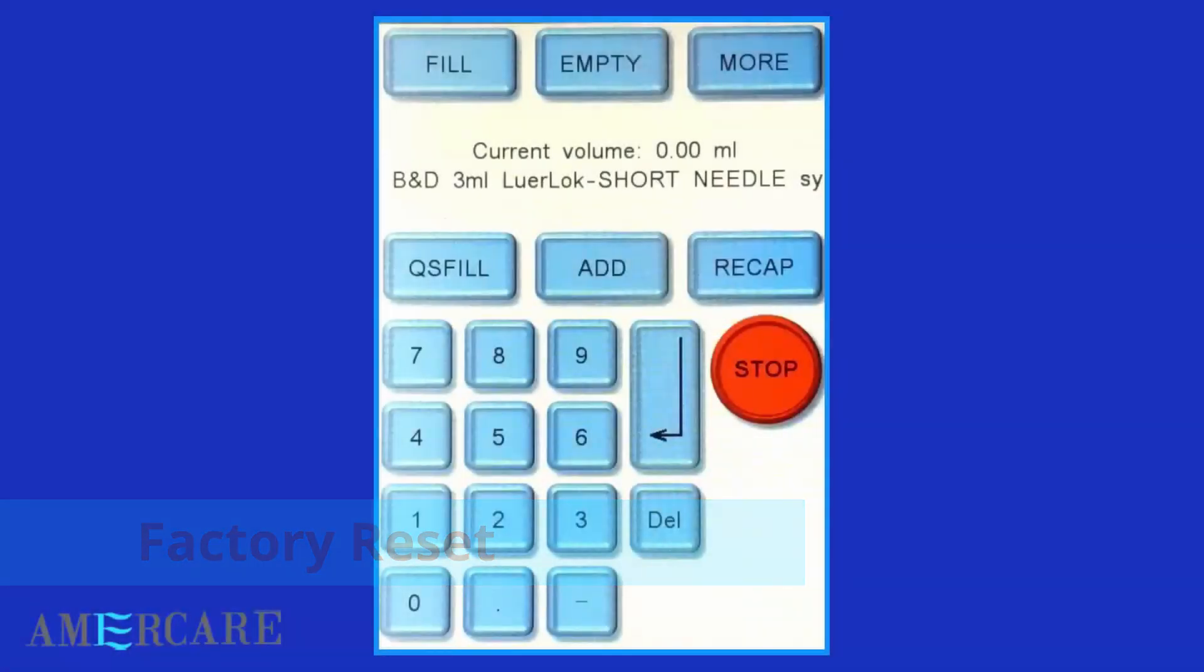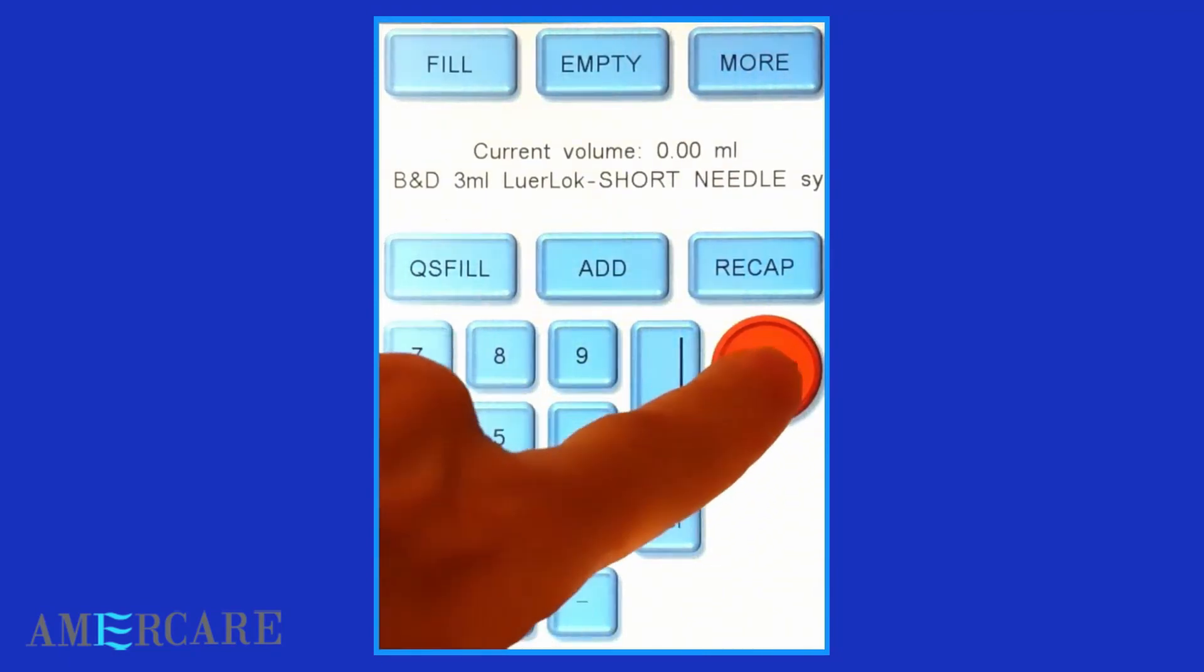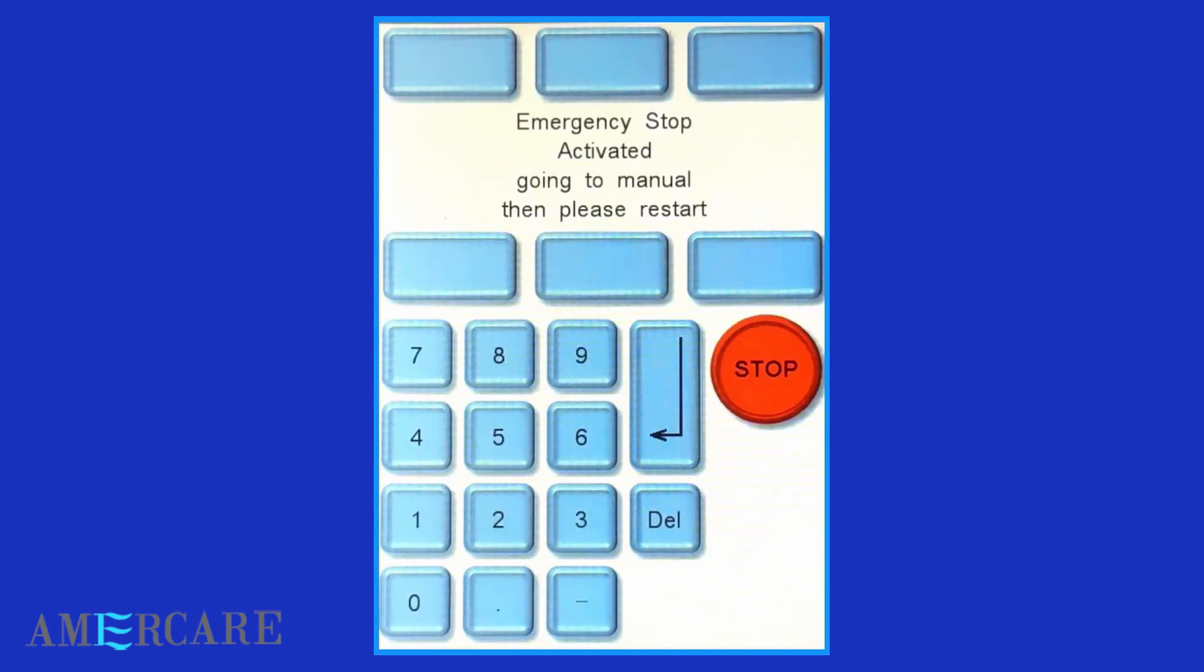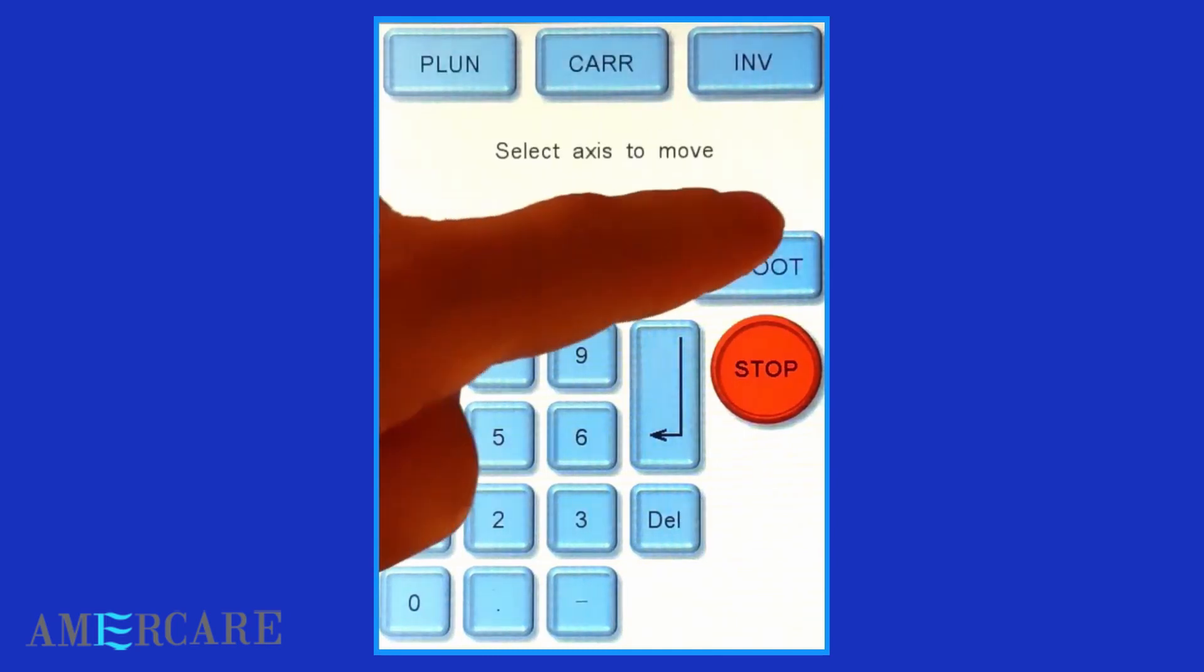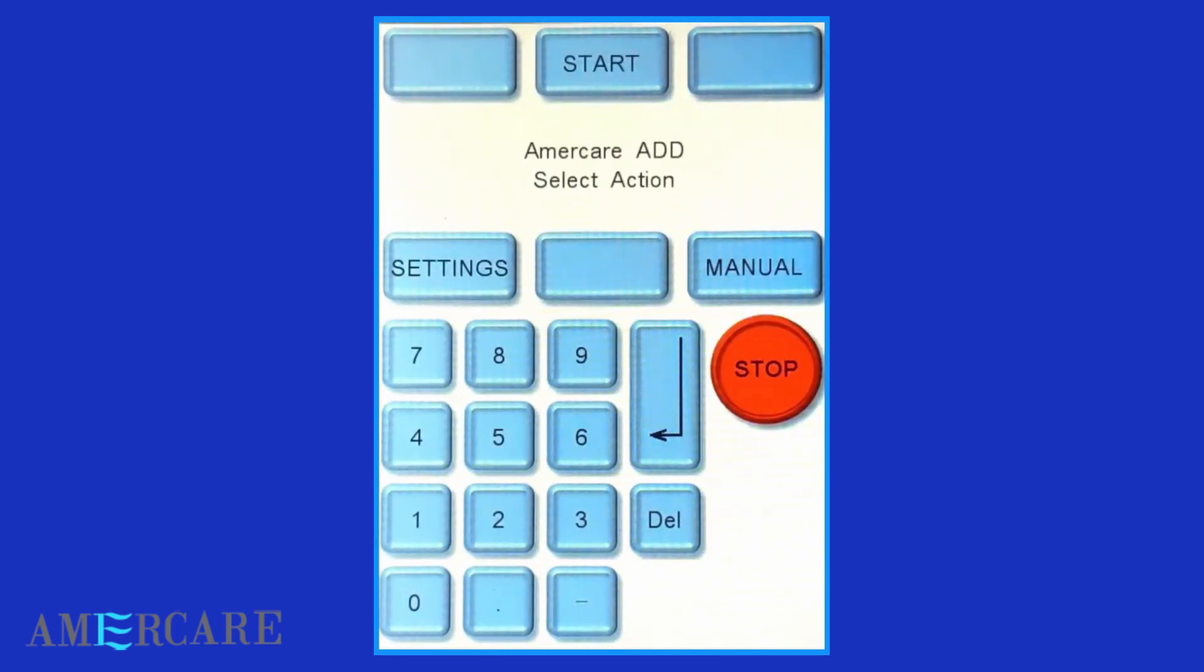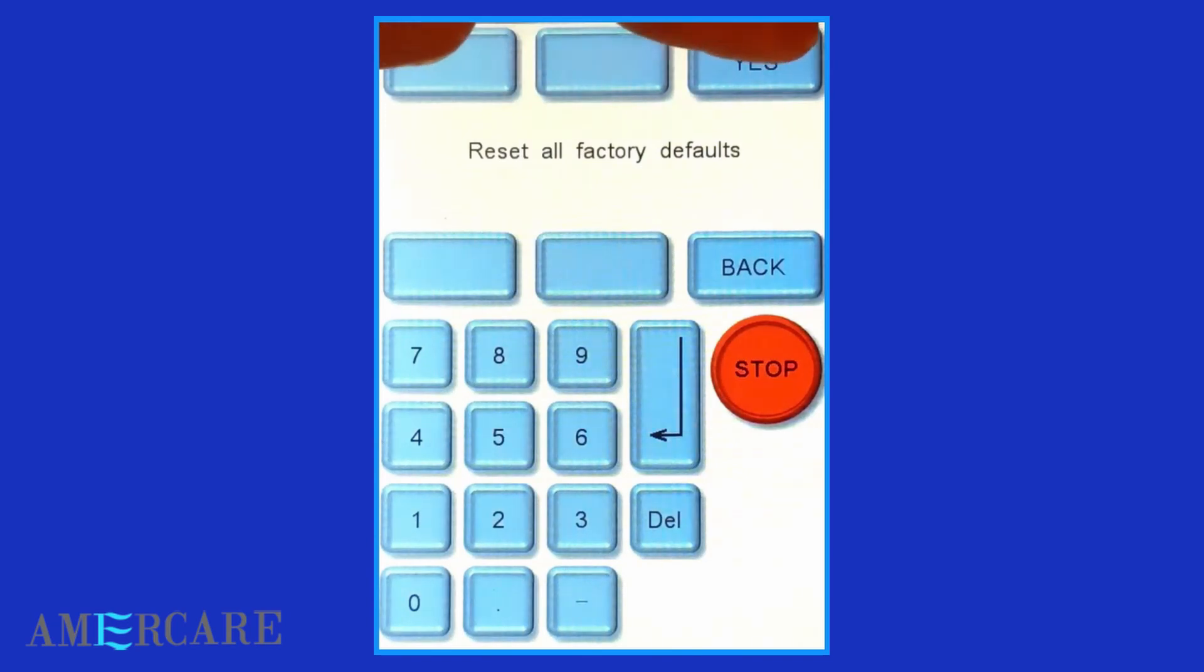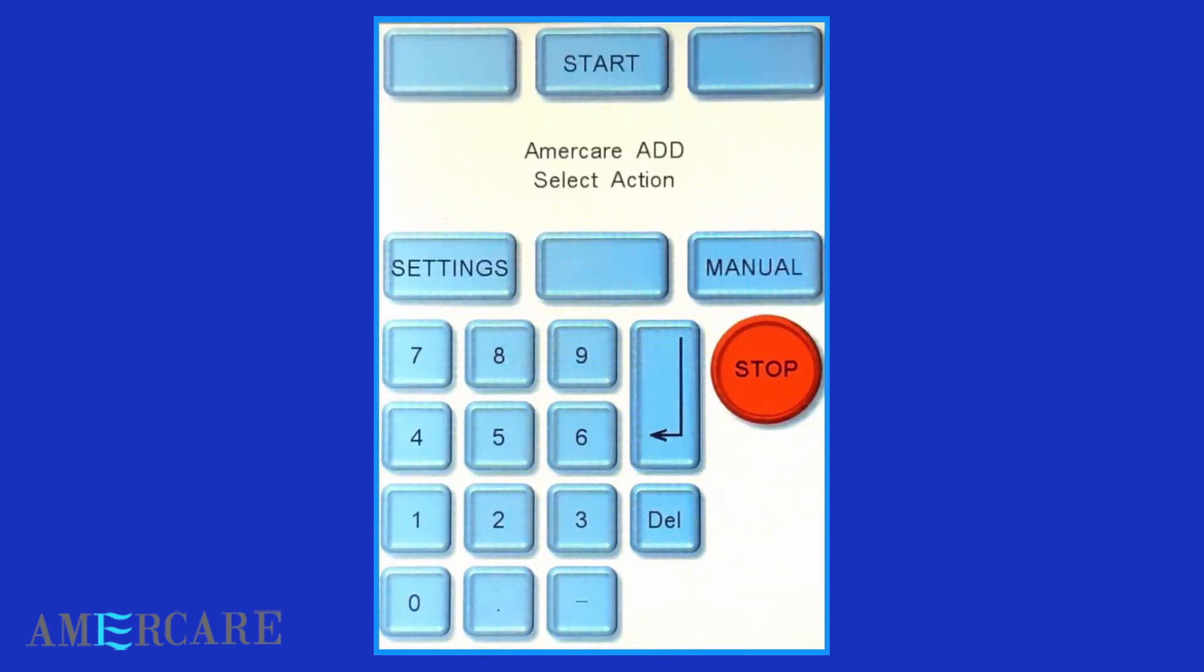As with any other computer controlled device, occasionally it will need resetting. To do this, press stop, press reboot, press settings and press reset. Then press yes to reset to the factory defaults. You will then need to press start to datum the unit.